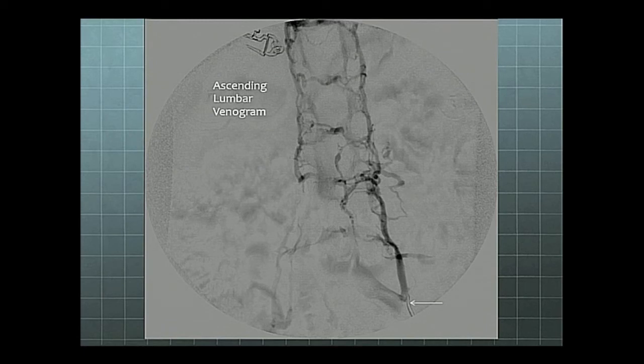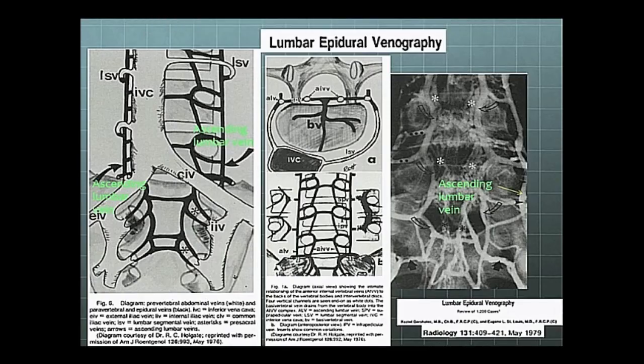Hand injection, you should see these nice structures here, these nice octagonal structures. What they're coming from is, when you look at the ascending lumbar, there are suprapedicular veins, infrapedicular veins, and anterior vertebral veins, and you see them here on this cross section. They're anterior because they run the anterior of the spinal canal. Here again, a very nicely demonstrated venogram.